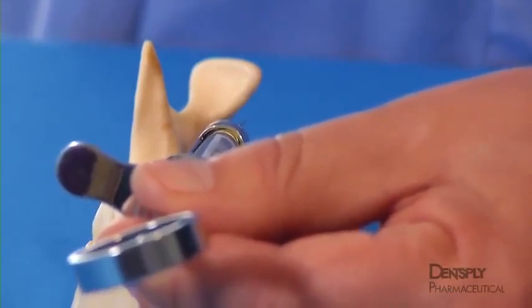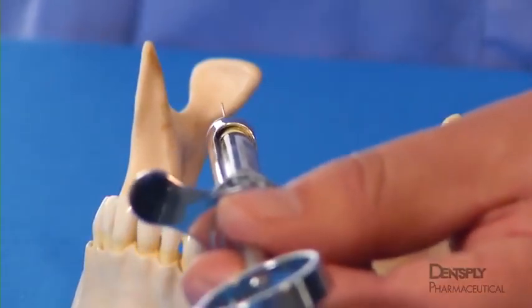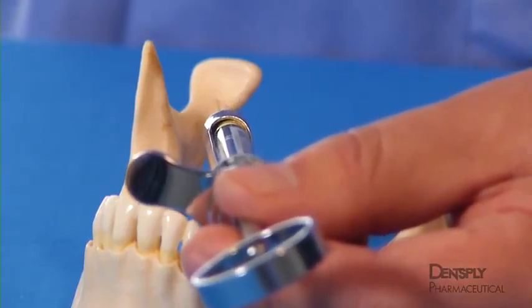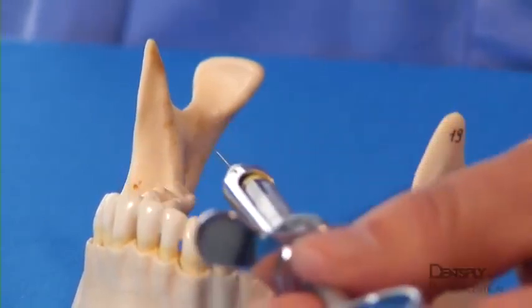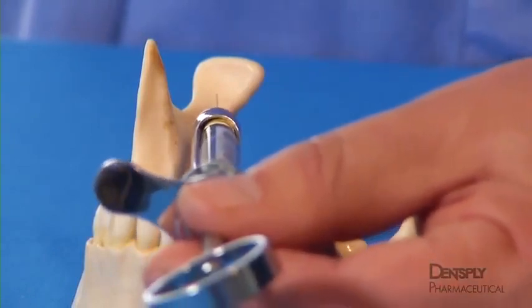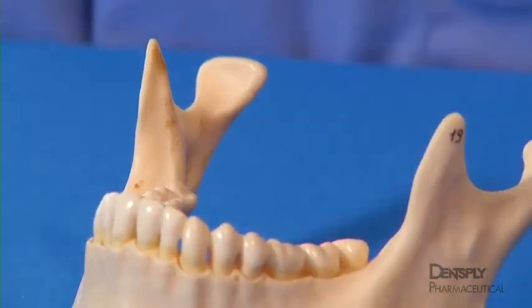medial. Correction involves ensuring that the point of insertion is just medial to the deep tendon of the temporalis muscle and appropriately reorienting the barrel of the syringe. For instance, if the insertion point is correct but bone is contacted prematurely, then the needle should be partially withdrawn and the barrel of the syringe moved mesially along the contralateral quadrant before reinserting the needle to the final depth.